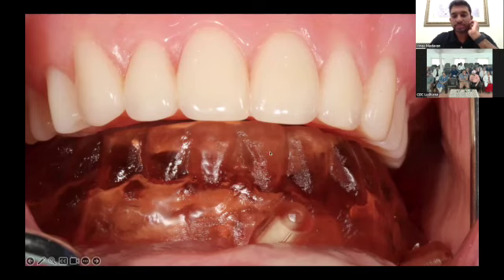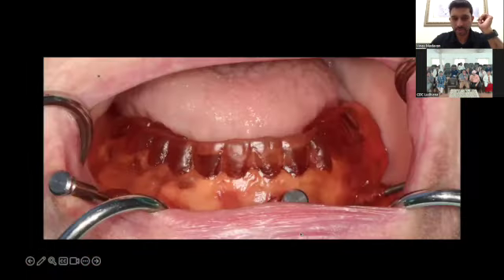So in this patient, because we had already processed the maxillary and mandibular denture, what you could do is a bite registration as the patient closes down in centric with her existing denture, right? And then you save that bite registration or your occlusal record, and then you put this guide. That way it locks into the same position, right? So once you do that, you ask the patient to bite down, and then you go ahead and drill these anchor pins and then secure the first guide. So this is where the first guide is secured, right?